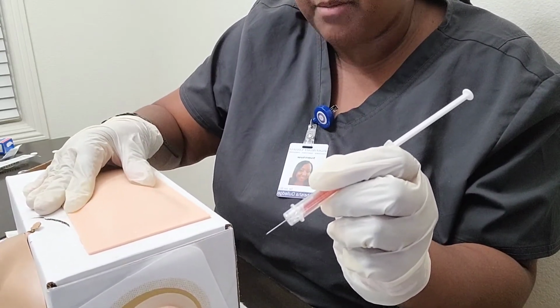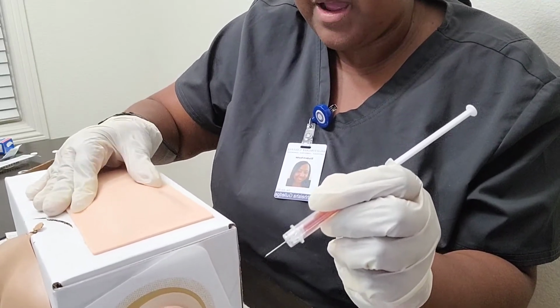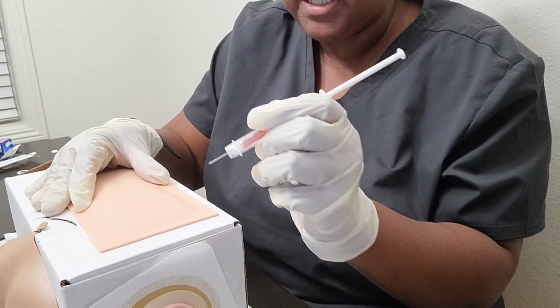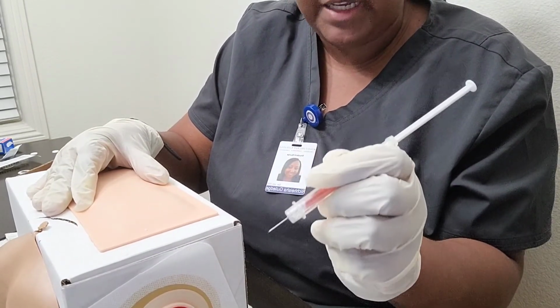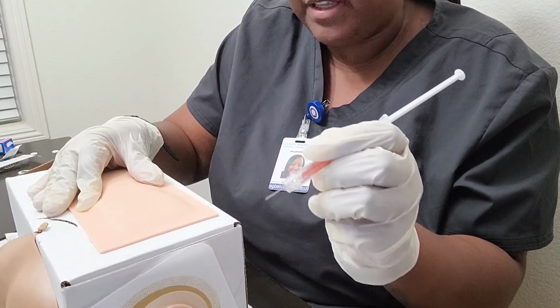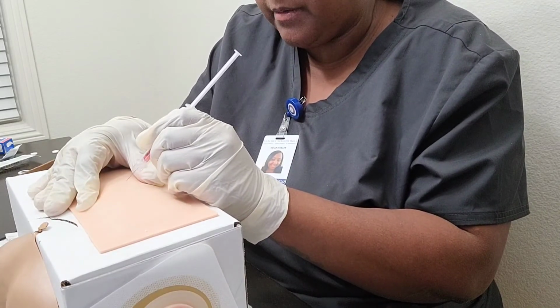I can't really do that with this one, but I'm going to go ahead and pinch it, and I'm going to inject the needle quickly and firmly at a 45 to 90 degree angle, and then release the skin if it's pinched. So I'm going to go ahead and do that.